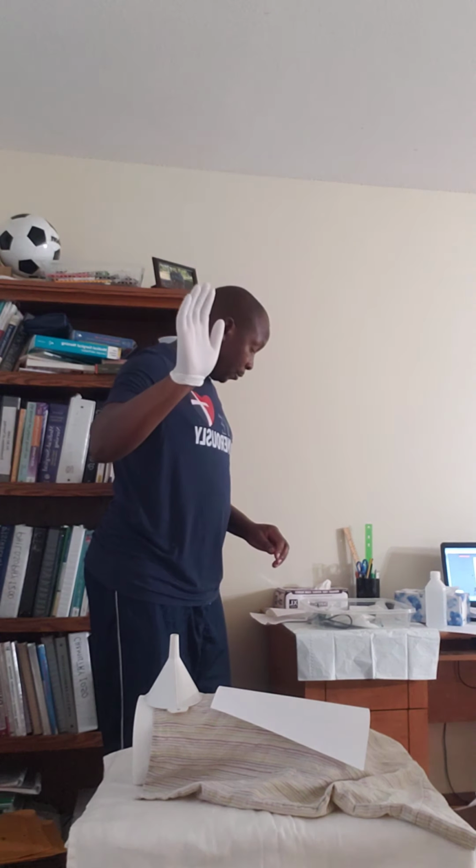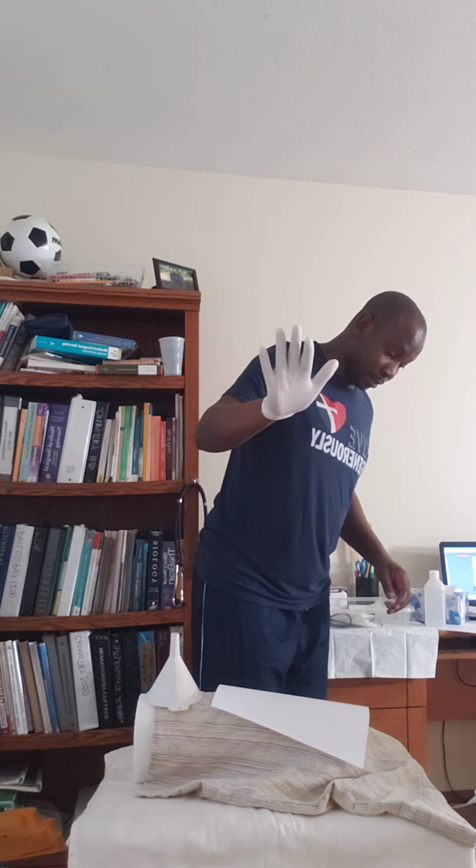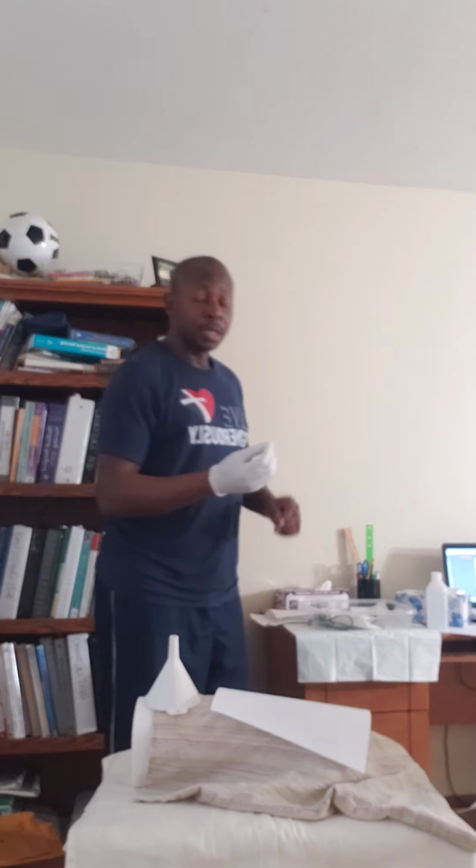Done. So now, one arm is going to remove the cannula. When removing the cannula, it has to be removed according to the way it's sitting. If the cannula is at 9 or 3, it has to be inserted this way.